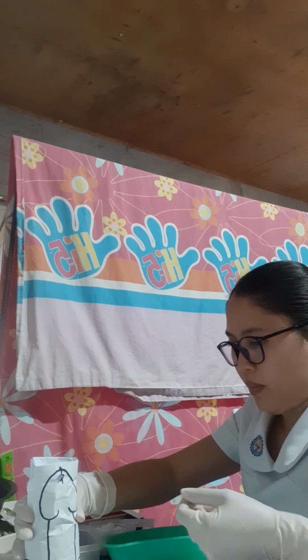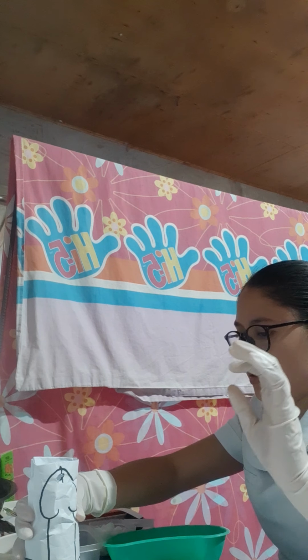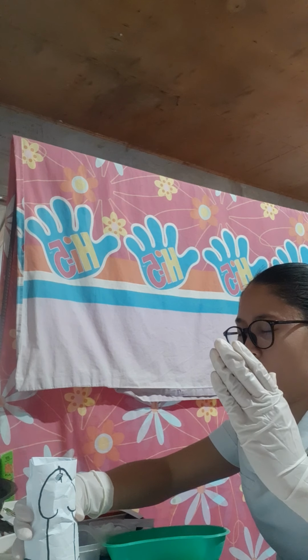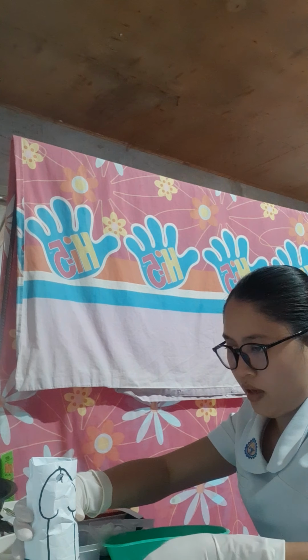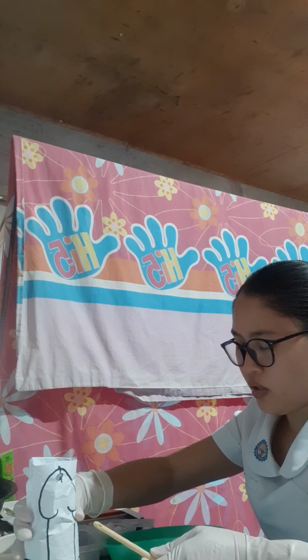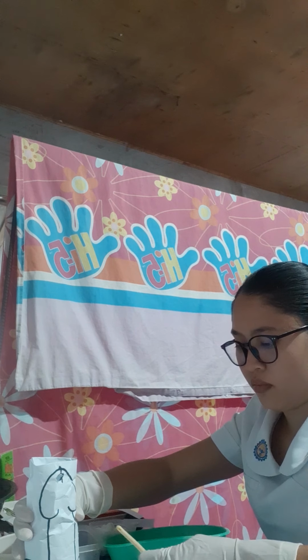Then pick up the catheter with the gloved hand 7.5 to 10 centimeters, which is 3 to 4 inches from the catheter tip, and hold the end of the catheter loosely coiled in the palm.